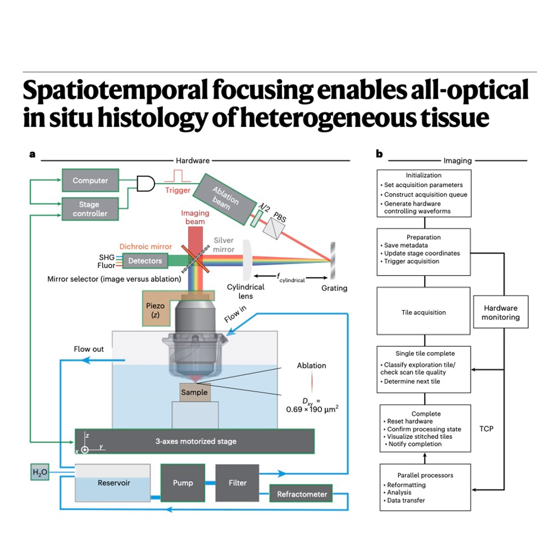Precisely. They chose their medium carefully, a mix of 60% DMSO and 40% water, with a buffer, because it had a good balance of low viscosity to help flush bubbles and a relatively high ablation threshold. But they knew RI drift would still happen. How bad could that drift be?